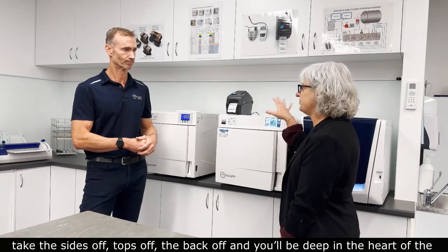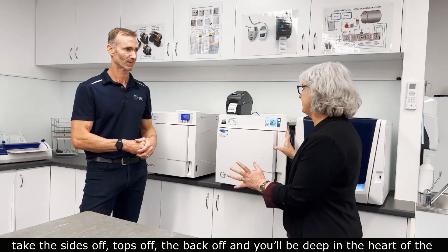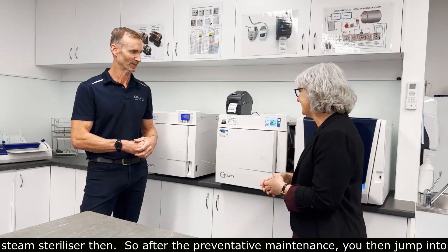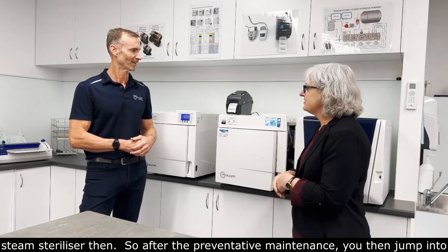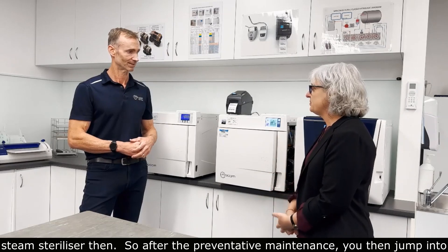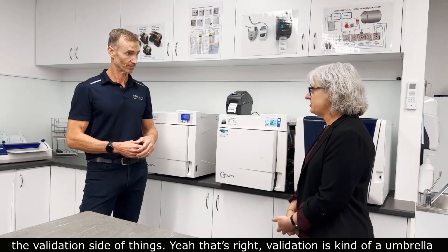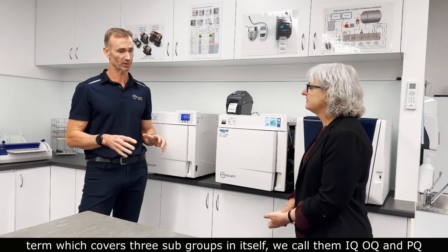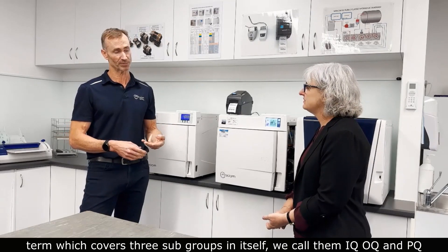So you'll come along, take the sides off, the top off, the back off, and you'll be deep in the heart of the steam steriliser. That's right. So after the preventative maintenance, you then jump into the validation side of things. Validation is kind of an umbrella term which covers three subgroups in itself.